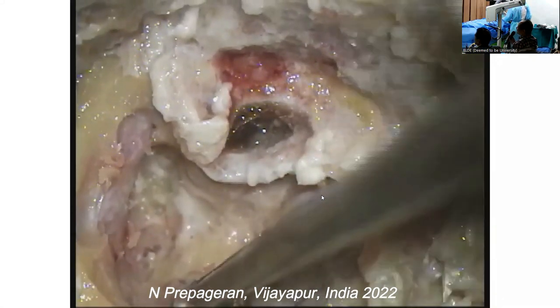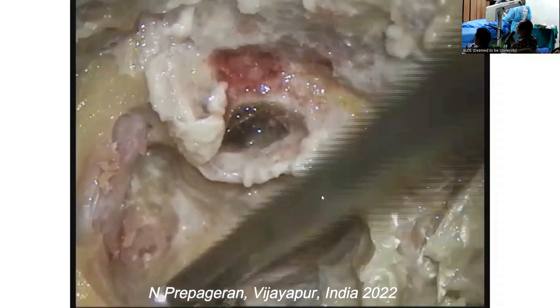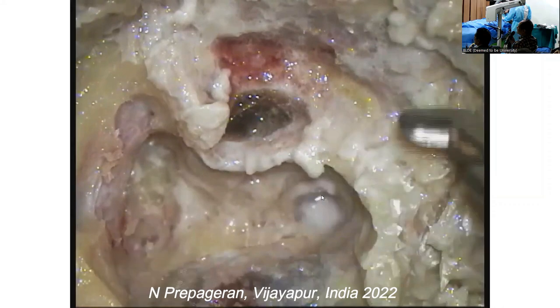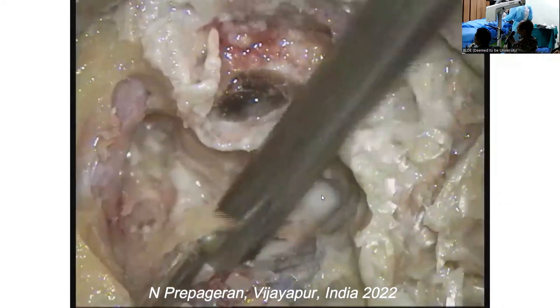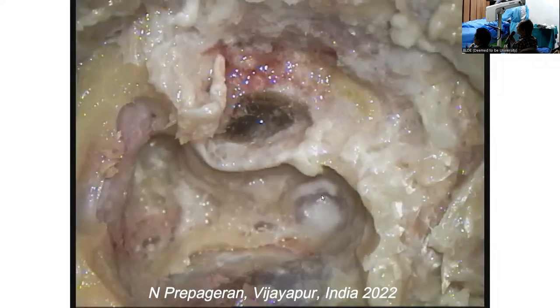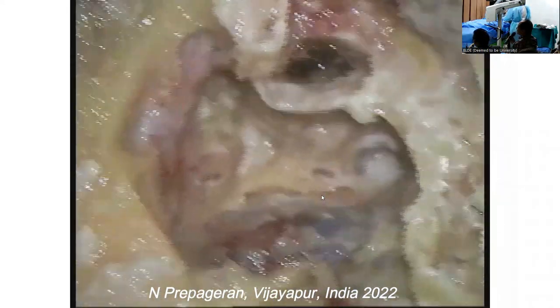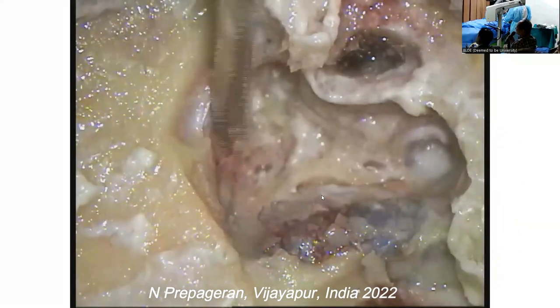Remember I was telling you that for me, the burr is very precious because we reuse our burrs, and each burr is very expensive. So I try my best to minimize burr use. Okay, burr again, drill again.